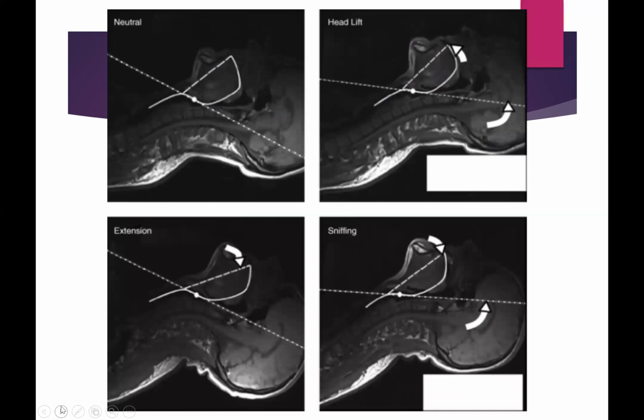And this is just an example. I included pictures of the patient's neck during an intubation procedure. Oftentimes, especially during bag valve mask ventilation or during intubation, when people are assisting getting the patient in a proper position, they tend to overdo the extension of the neck. Just look at the angles of where the tube has to go.